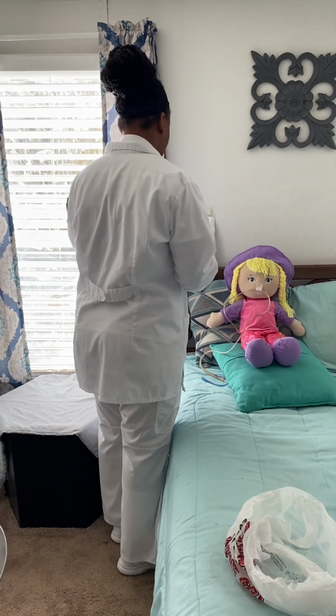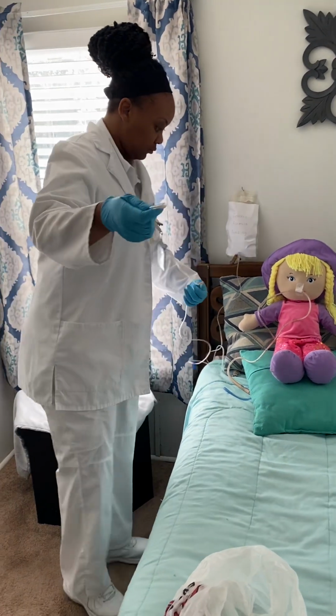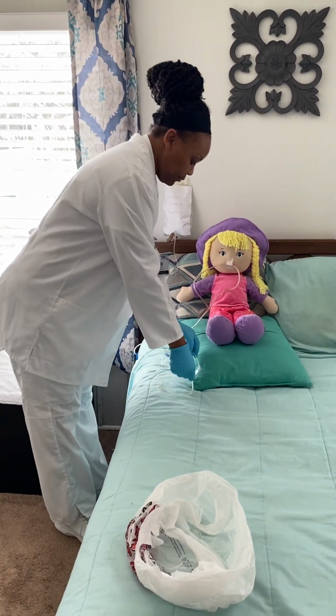I will go ahead and connect my feeding to the pump. I will open it up and allow it to prime. Once I have it primed, I will close that back up.